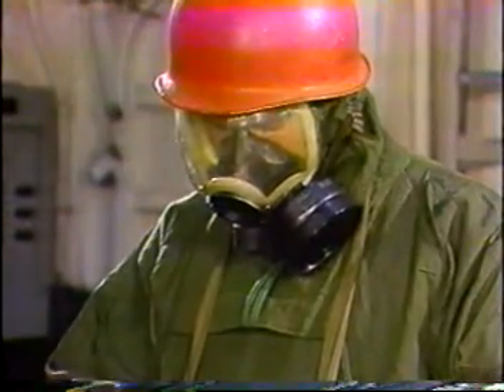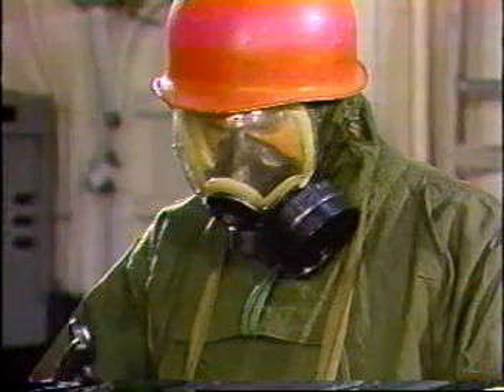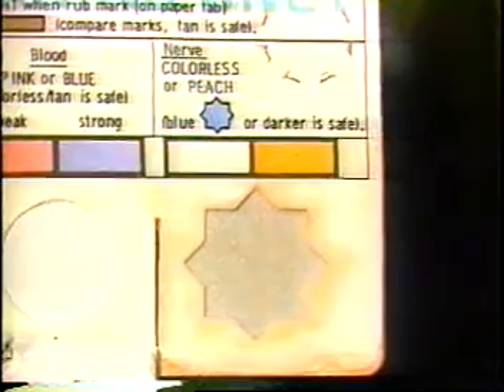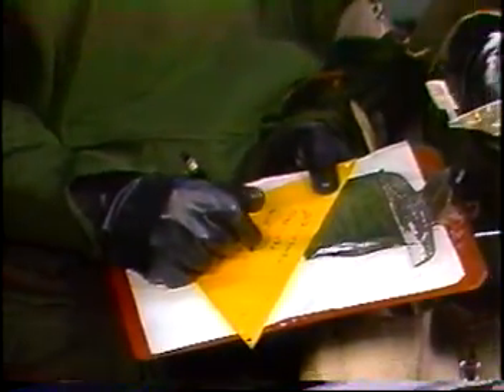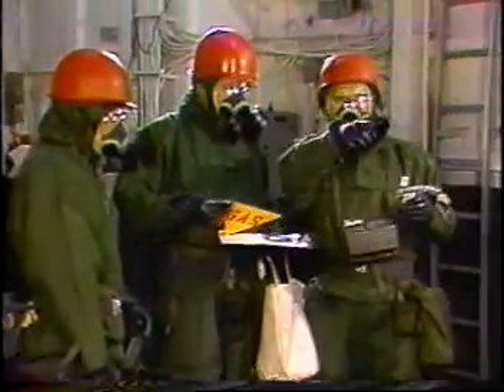When the blood agent test spot shows blue, verify the results with a second test using a new sampler detector. Do only the blood test portion of the test procedure. If a nerve agent is present, the test spot would be colorless or peach, indicating the presence of a vapor nerve agent. The monitoring and survey team marks the area to indicate the kind of agent, the date, and the time of day.